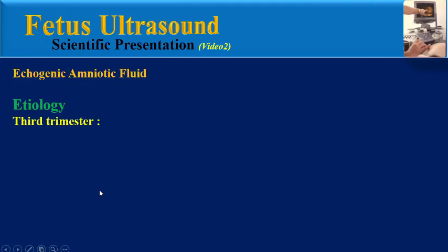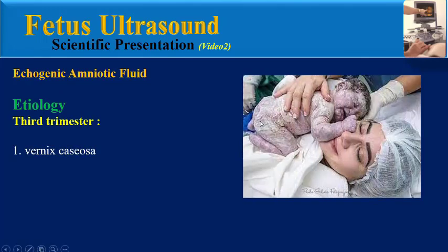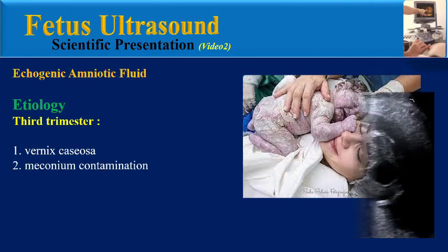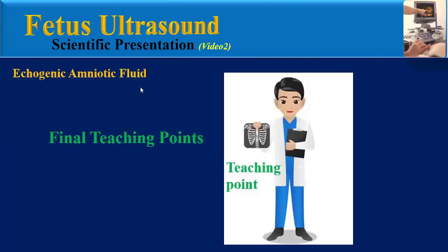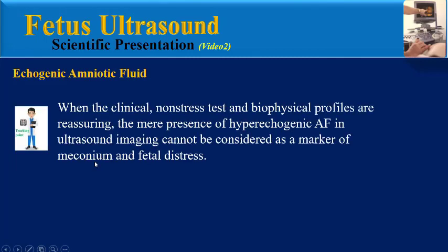In the third trimester, the most common causes are again vernix caseosa and meconium contamination. Please pay attention to these final teaching points: when clinical non-stress tests and biophysical profiles are reassuring, the mere presence of hyper-echogenic amniotic fluid on ultrasound imaging cannot be considered a marker of meconium or fetal distress.